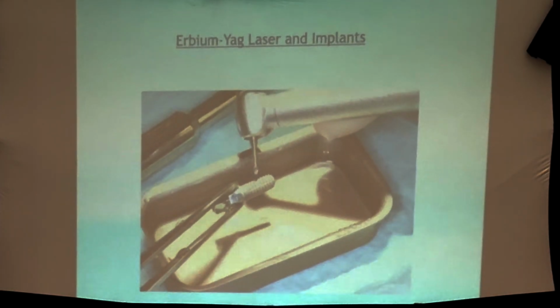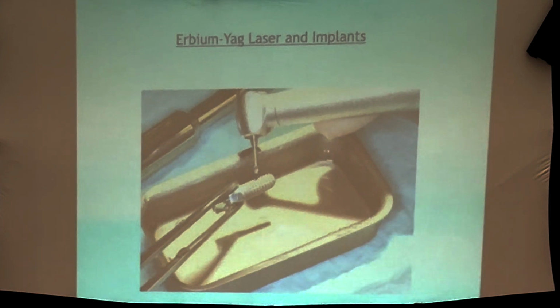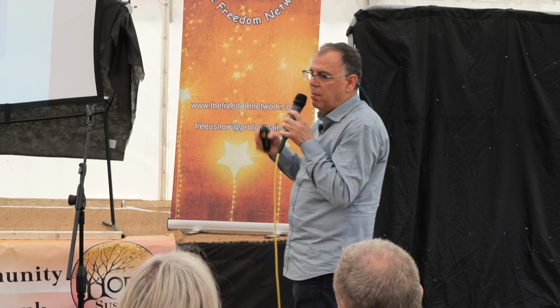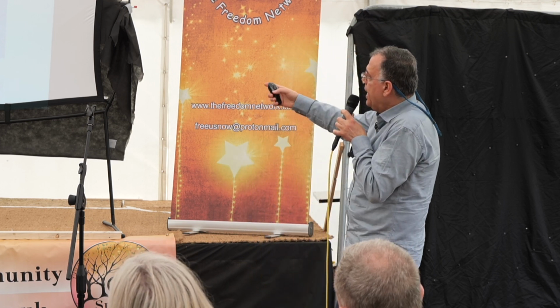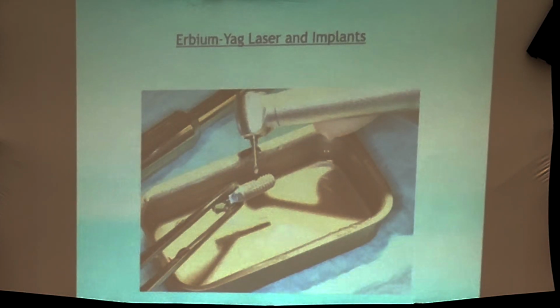Uses of laser application in implants and implant surgery. So many uses that we can do here, and we can save time, money, and hassle for the patient, and so many things. This implant there, I lost it 3 months after the insertion. It was loose inside the mouth of the patient. Took it out and screwed it, bombarded with laser, as you can see the tip fiber of the laser. And inserted it again, screwed it again into the socket, and wait for another 3 months.